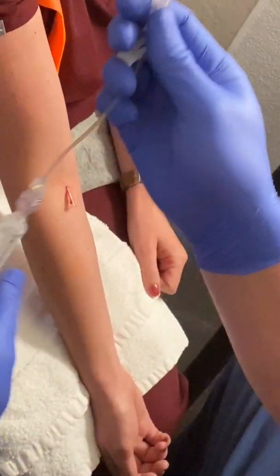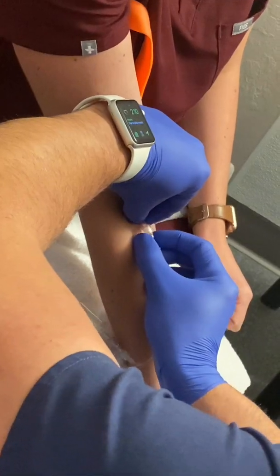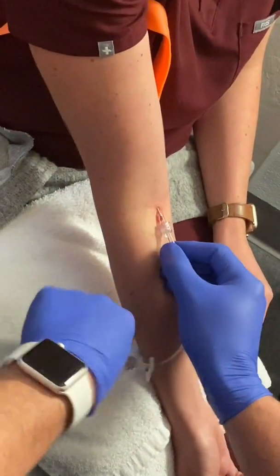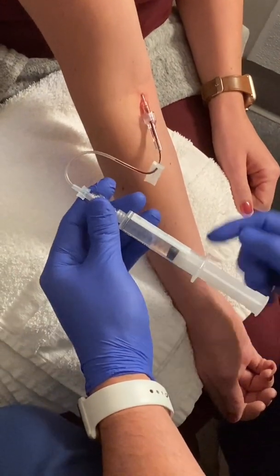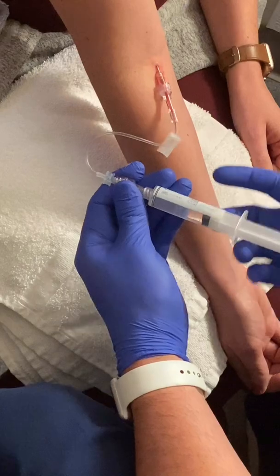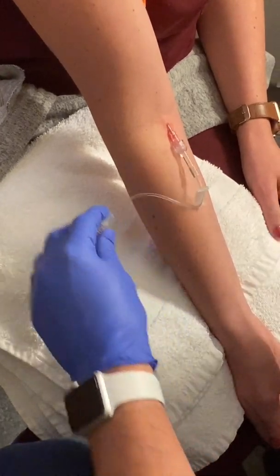Grab your saline lock and your flush, make sure it's primed. Make sure you have fluid that comes out of it, and we do. Pinch, push, twist. This is where I will pull back on the syringe to make sure I get good blood return. As you can see here, I have great blood return, and then I'm going to push it and make sure it doesn't infiltrate or blow, and it flows nicely. And it's flowing really, really nice.